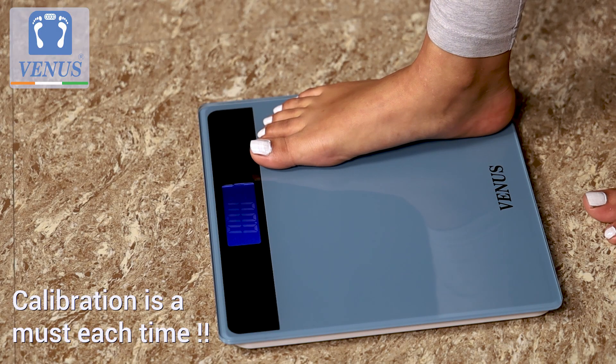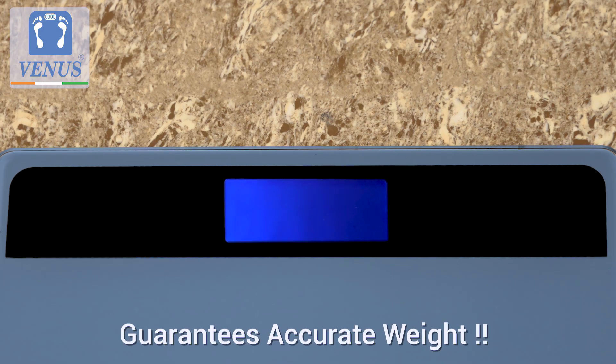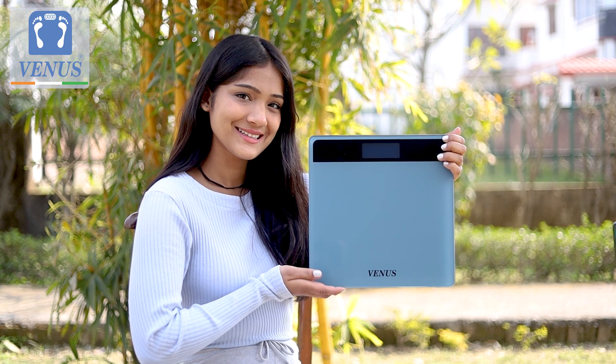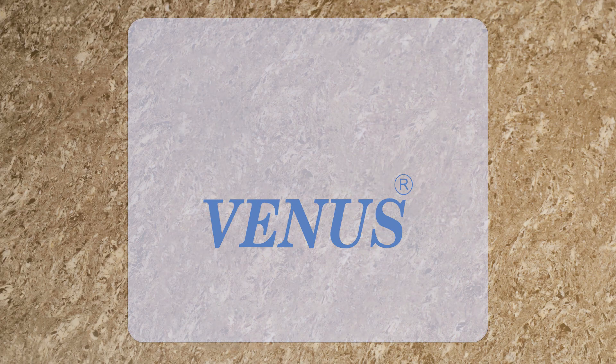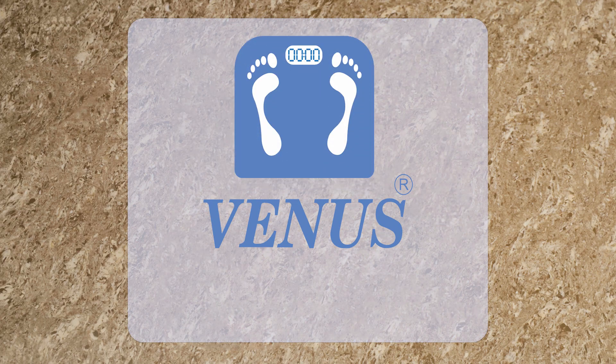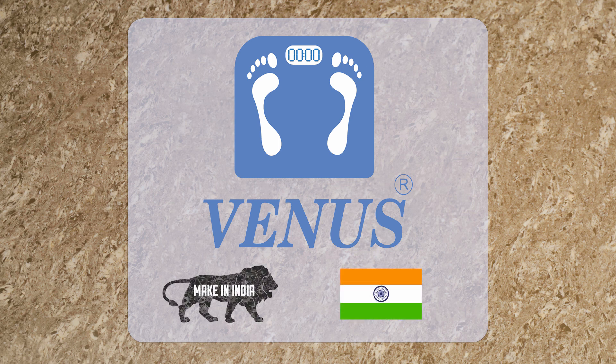Do remember that calibrating the machine each time guarantees accurate reading at all times. So what are you waiting for? Get your Venus Body Weighing Machine today. Venus, your partner for a healthy living, a made in India product.